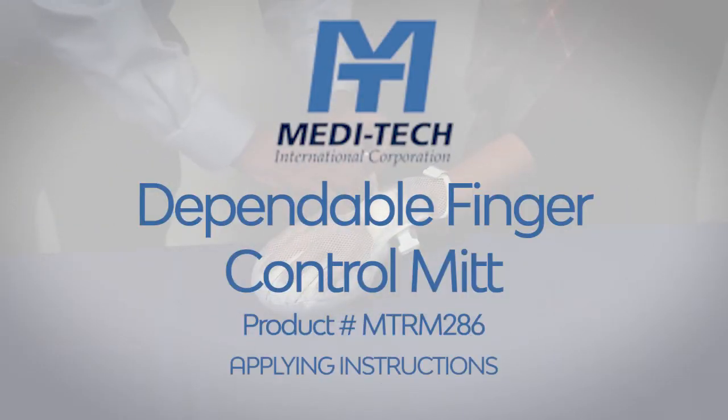Application instructions for the Meditech International dependable finger control mitt, product number MTRM286.